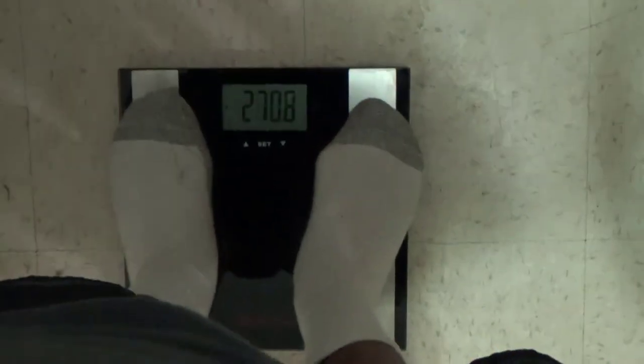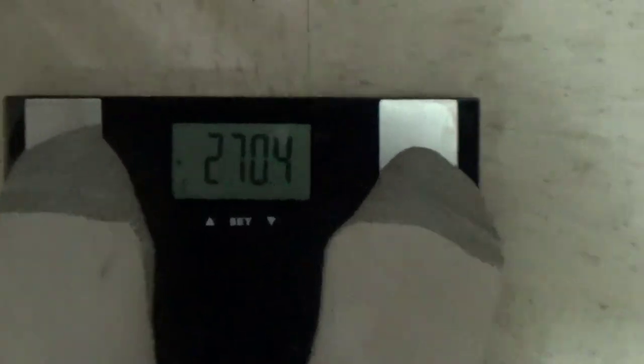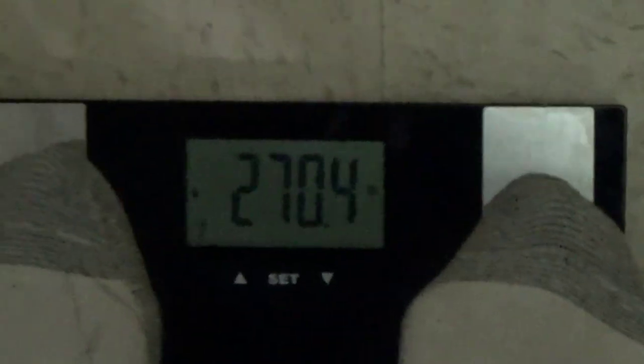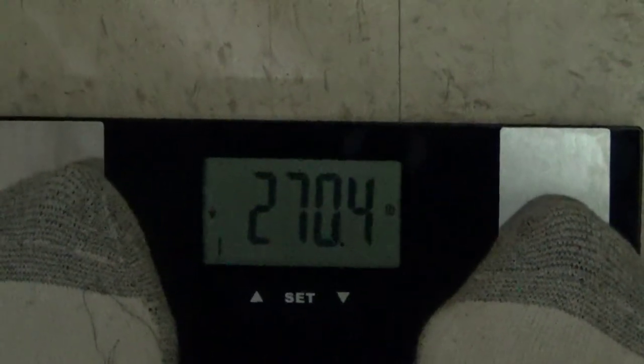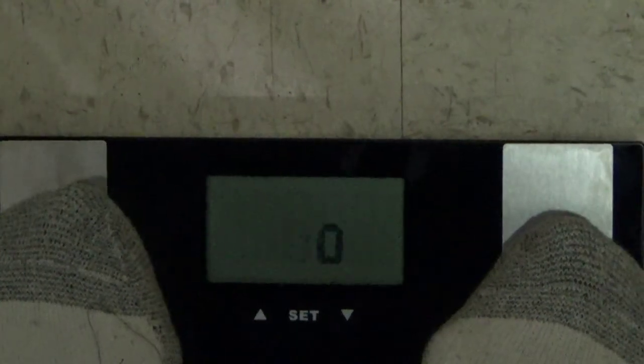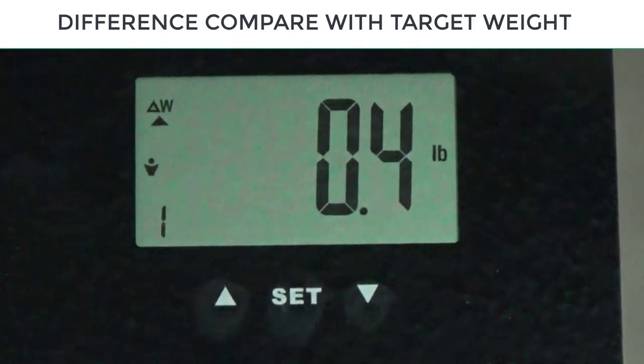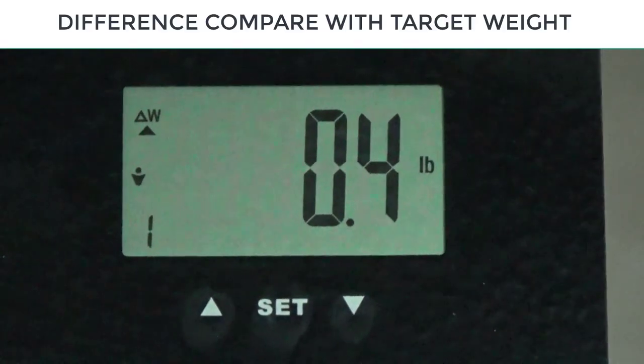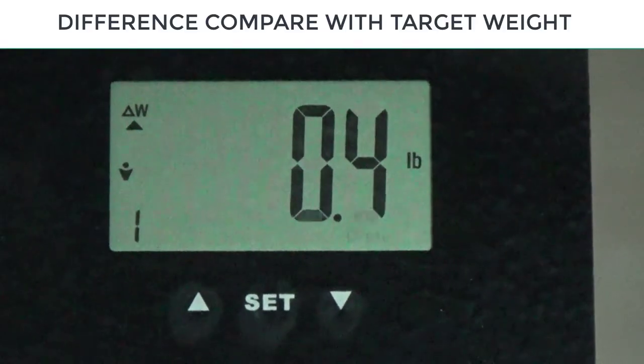Once it stops blinking and it's zeroed itself out, you can step on it. Make sure your feet are on the silver parts and it's gonna calculate your weight.